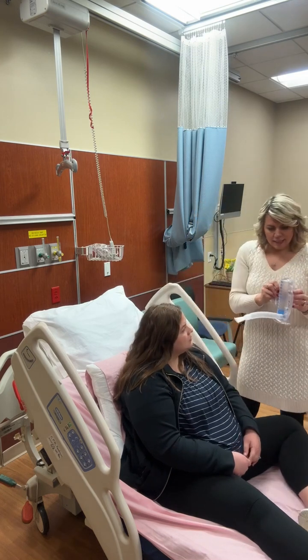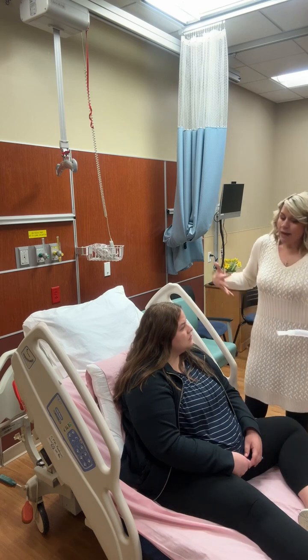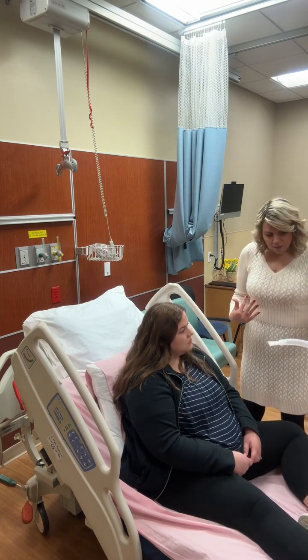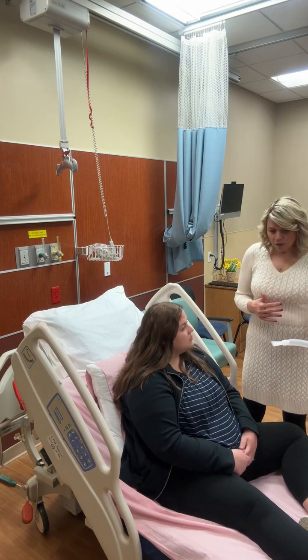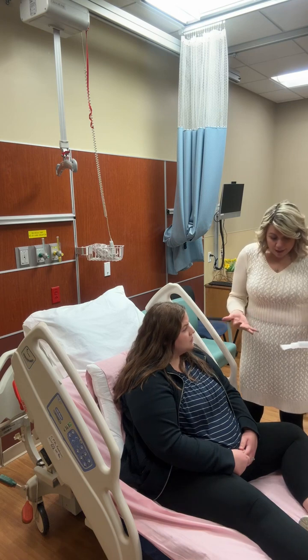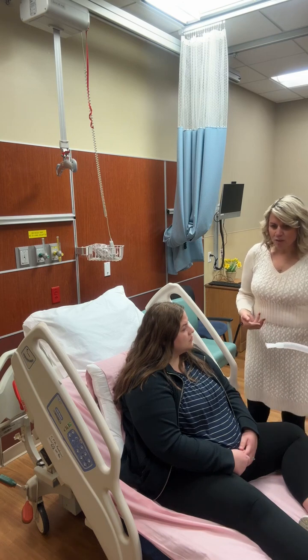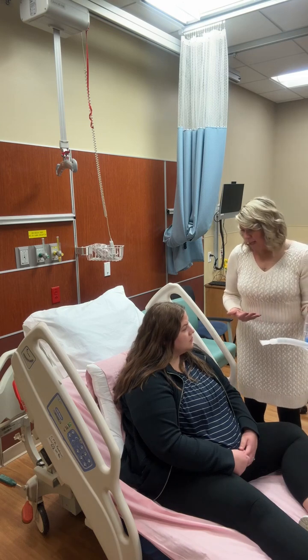Okay, Ashley. So the doctor ordered you on this incentive spirometer, and this is going to help expand your lungs. Right now you have pneumonia, so it's hard for you to take a deep breath in because of the fluid that's in there. So I want you to practice doing this. Doctor ordered it 5 times an hour while you're awake, so we won't bother you in the middle of the night. But it's important to do this.